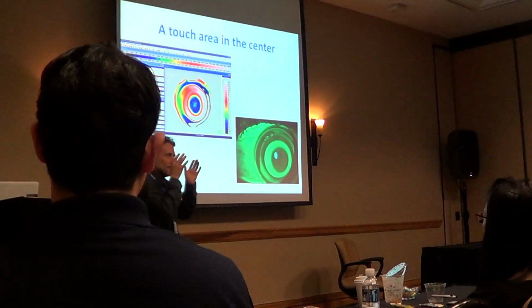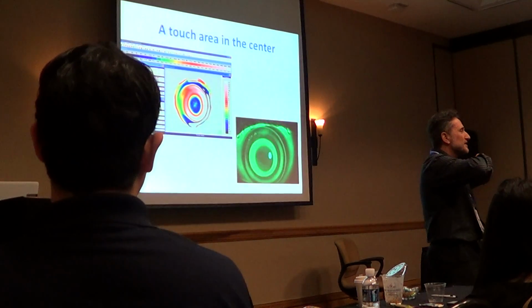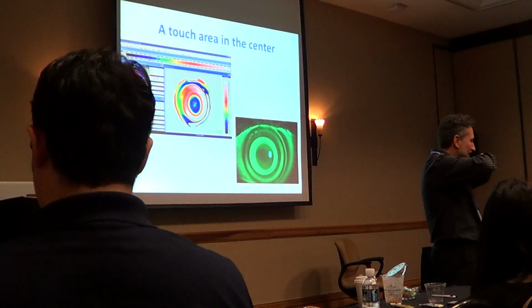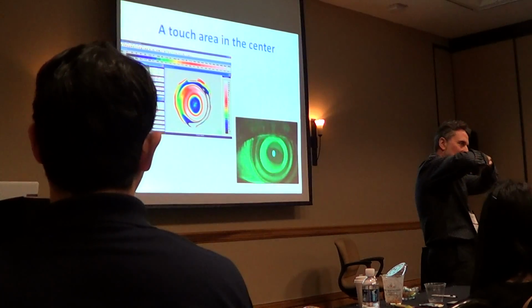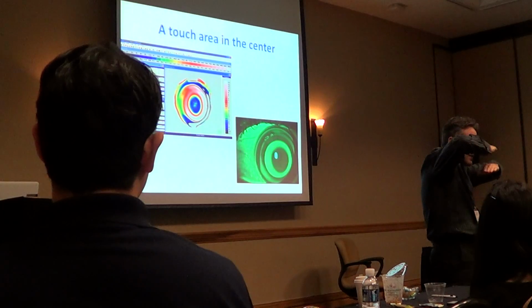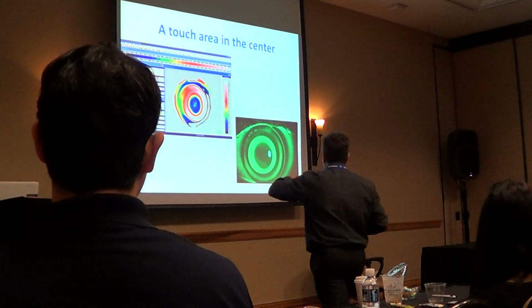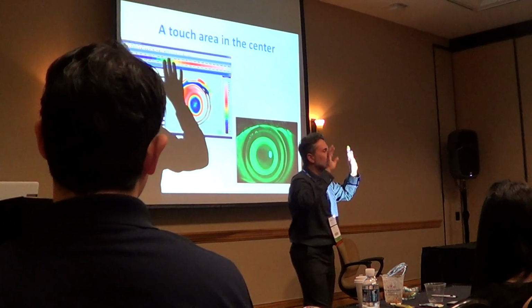Okay, if we follow this, if we just increase the sagittal height, if we just separate the back optical zone from the cornea, if we increase the height a little bit, we will obtain a centered zone, regular, patient happy, finished.